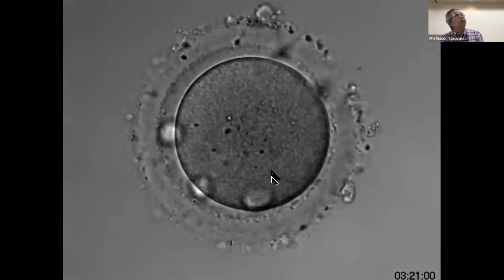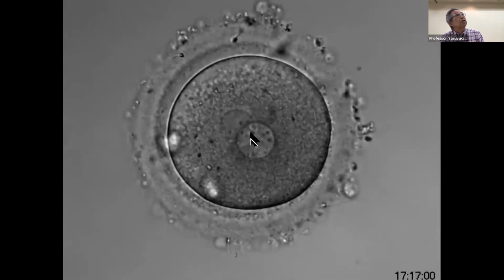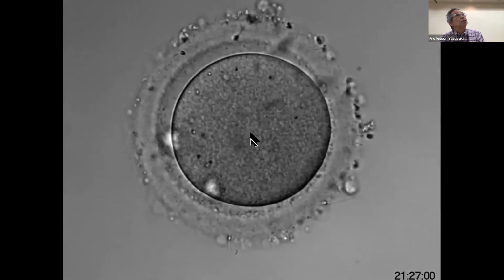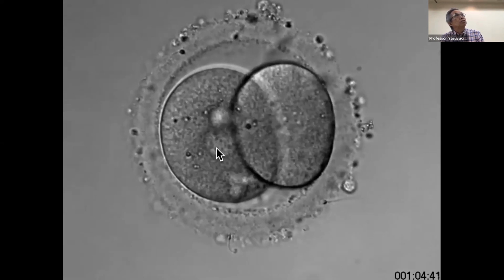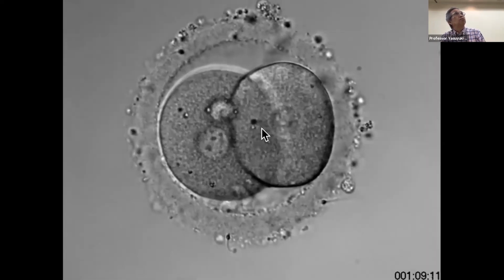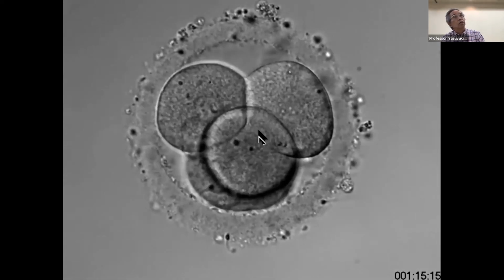Two pronuclei appeared and moved to the center of the ooplasm, reached syngamy, then first cleavage occurred. Within a 40 hours observation, this embryo cleaved twice and developed to the four-cell stage. This embryo is still in liquid nitrogen.